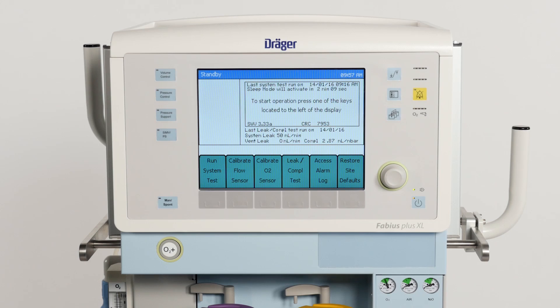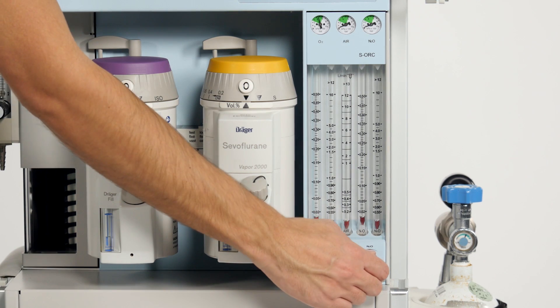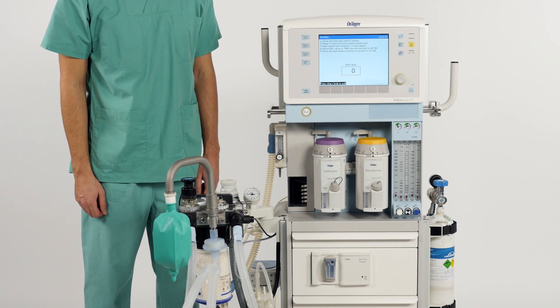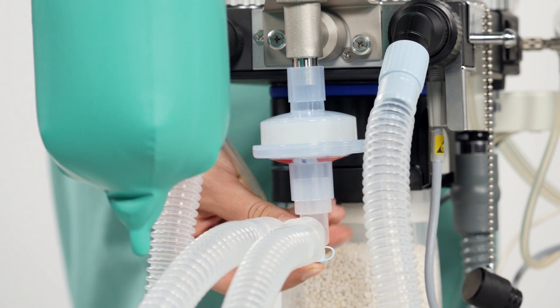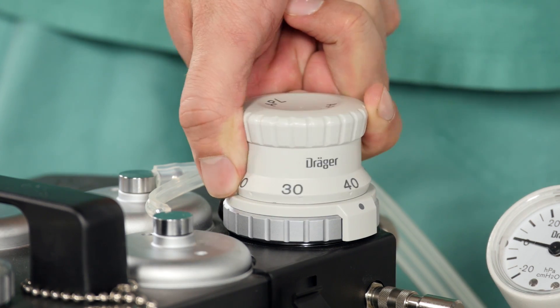Now that we have calibrated both sensors, we are going to perform the leakage and compliance test. Press the respective key and follow the instructions on the screen. Close all fresh gas control valves. Place the Y-piece on the plug located on the bag mount and seal the sample line connector if applicable. Switch the APL valve to manual and set a pressure between 40 to 50 hectopascal.